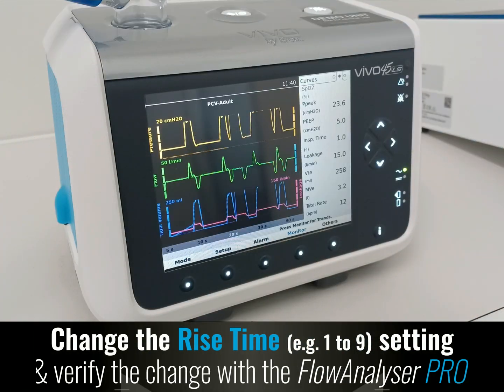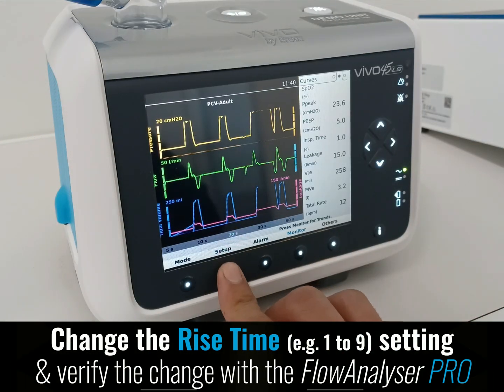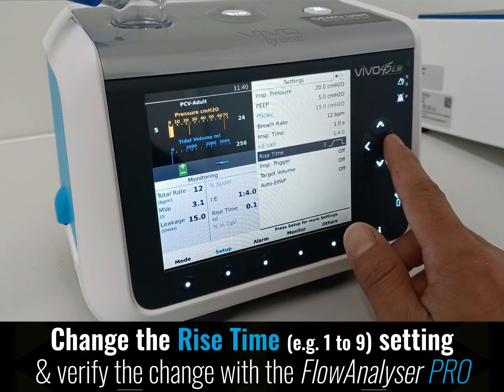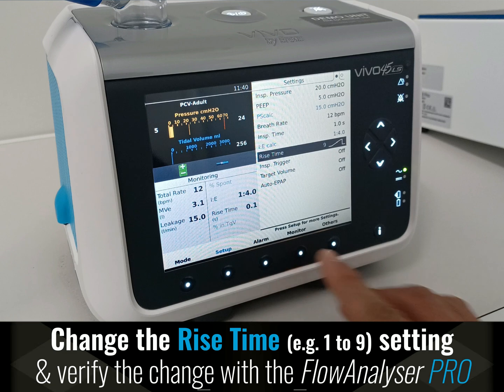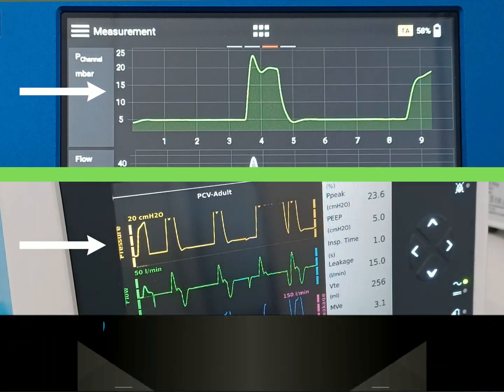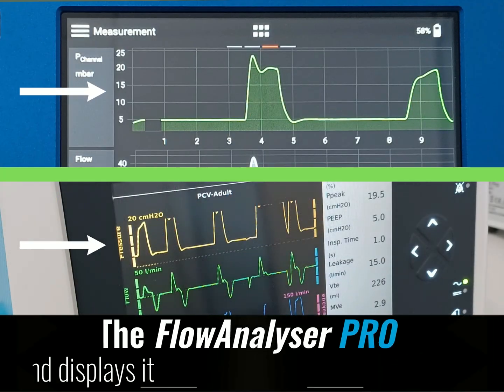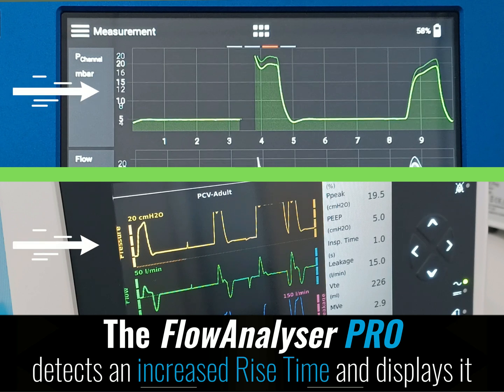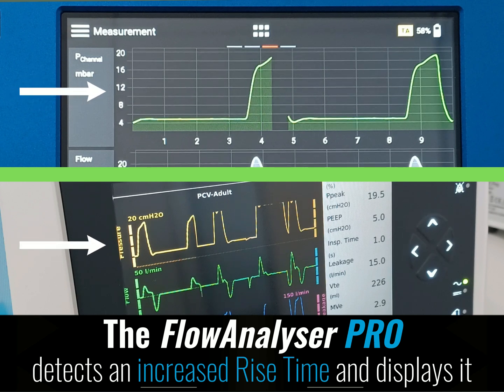Change the rise time setting from 1 to 9, and verify the change with the device. The Flow Analyzer Pro detects the increased rise time and displays it.